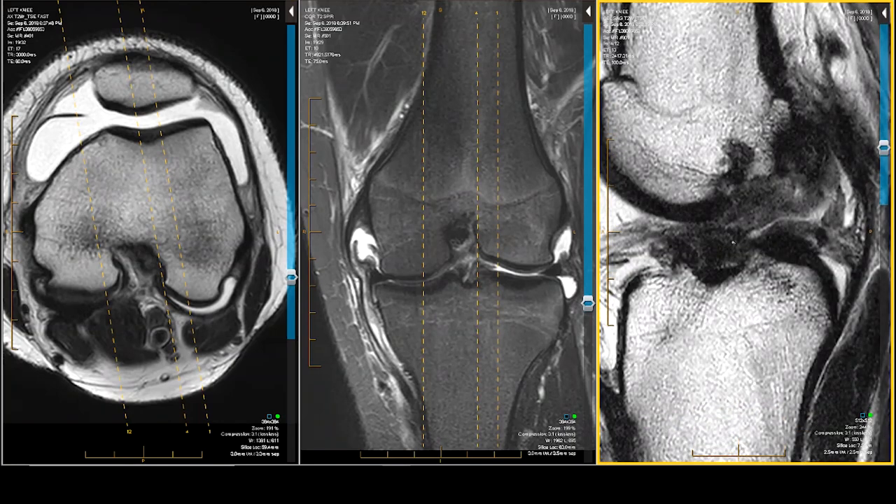It's pulverized. What is all that stuff? Blood, gore, inflammatory tissue, pseudo-ligament. There's nothing there.